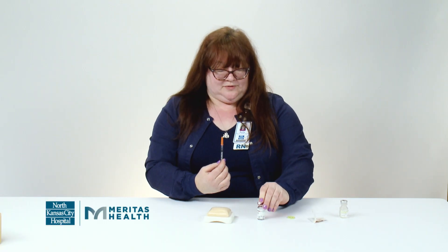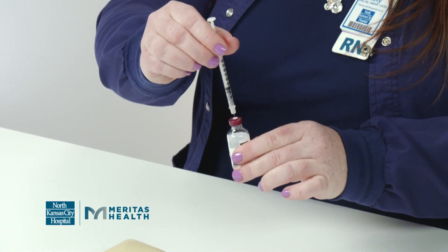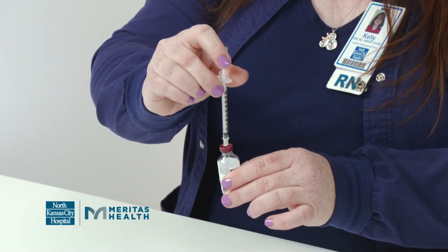Then you're going to wipe the top of the bottle off with an alcohol wipe. Take off the cap, then you're going to put the air that you just drew up on the syringe into the vial. This prevents bubbles when you draw up the insulin.